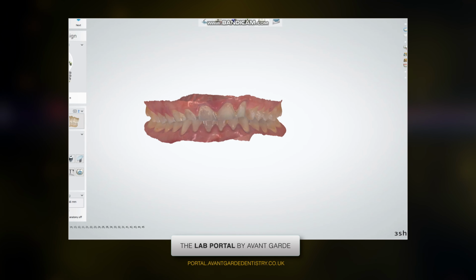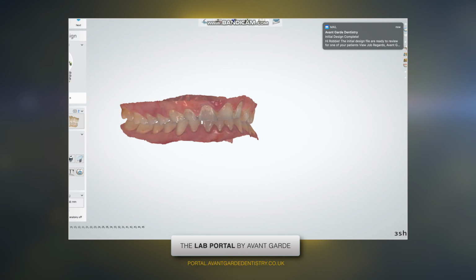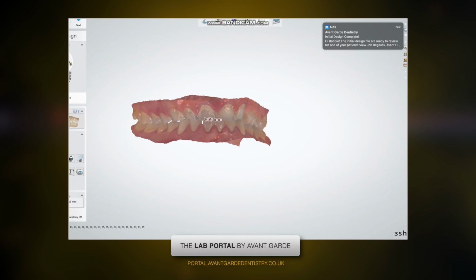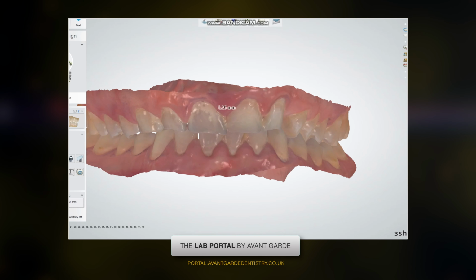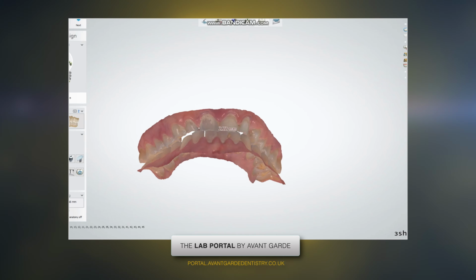So these videos are usually around 1 to 2 minutes long. Please take your time to have a look at these. This is quite a complex case because the planning involves a bit of gingiva, and understand some of the reasoning behind the design principles the lab has undertaken.